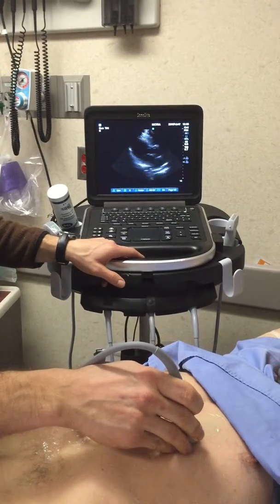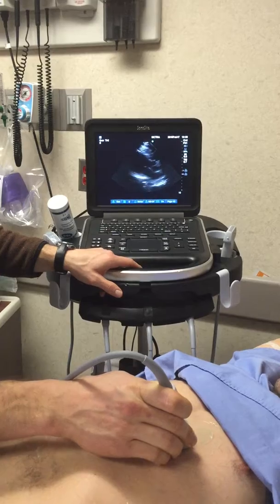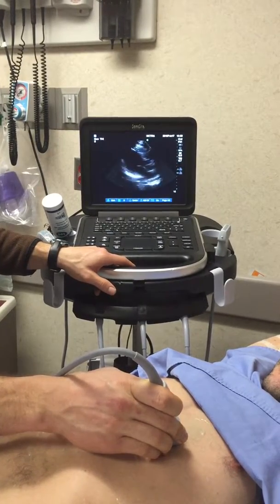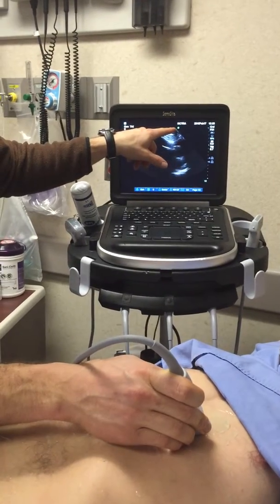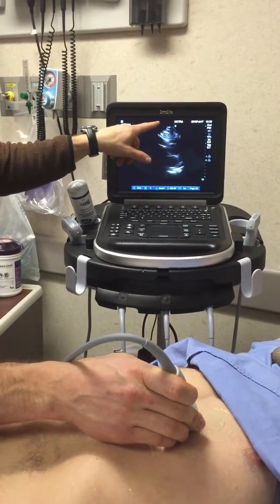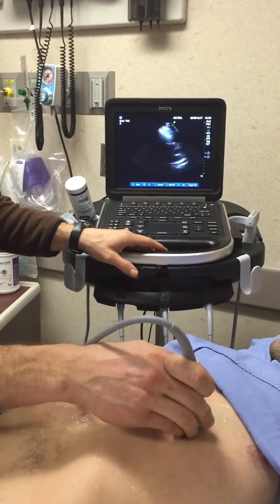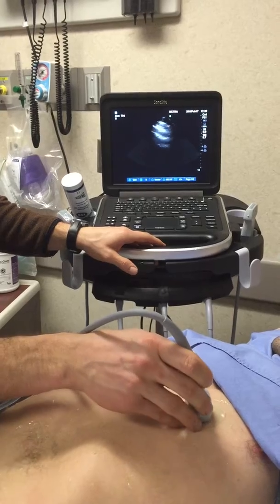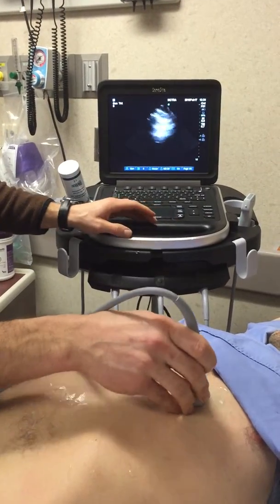We're going to discuss image acquisition for basic cardiac views. Starting with the parasternal long, the cardiac views are a little unique because the indicator, if you look on the screen, is actually on the right side of the screen, whereas almost every modality otherwise is on the left of the screen here. So with the cardiac parasternal long, you go in the long axis, oblique, with the indicator on the probe towards the patient's right shoulder.